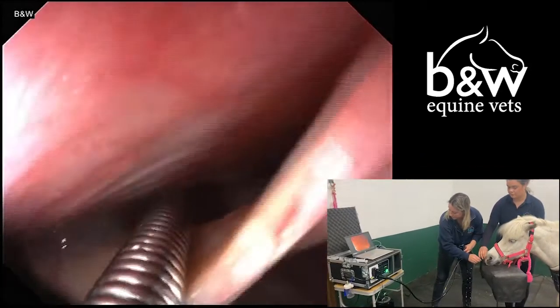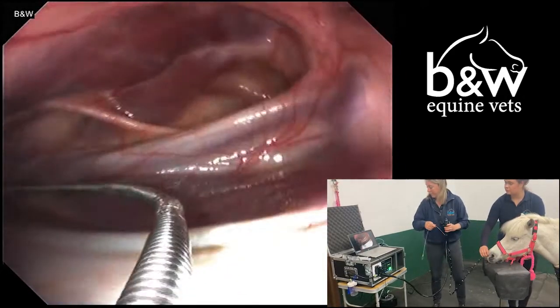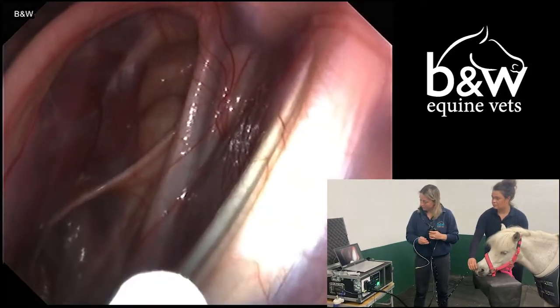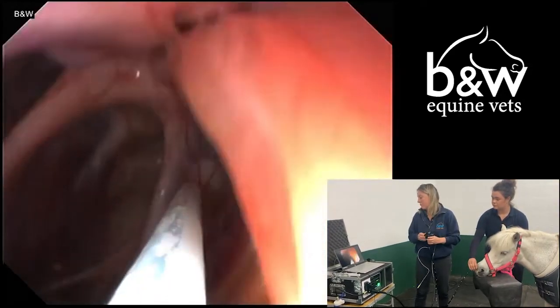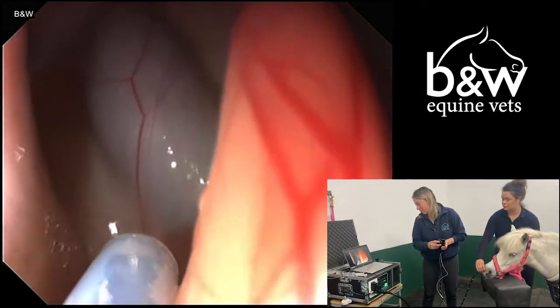So, in order to get into the pouch, we use a guide wire to help us dictate the direction of the endoscope as we pass it. Here we've passed into the pouch and now we will exchange the guide wire for a plastic pipe which we can use to perform our wash.